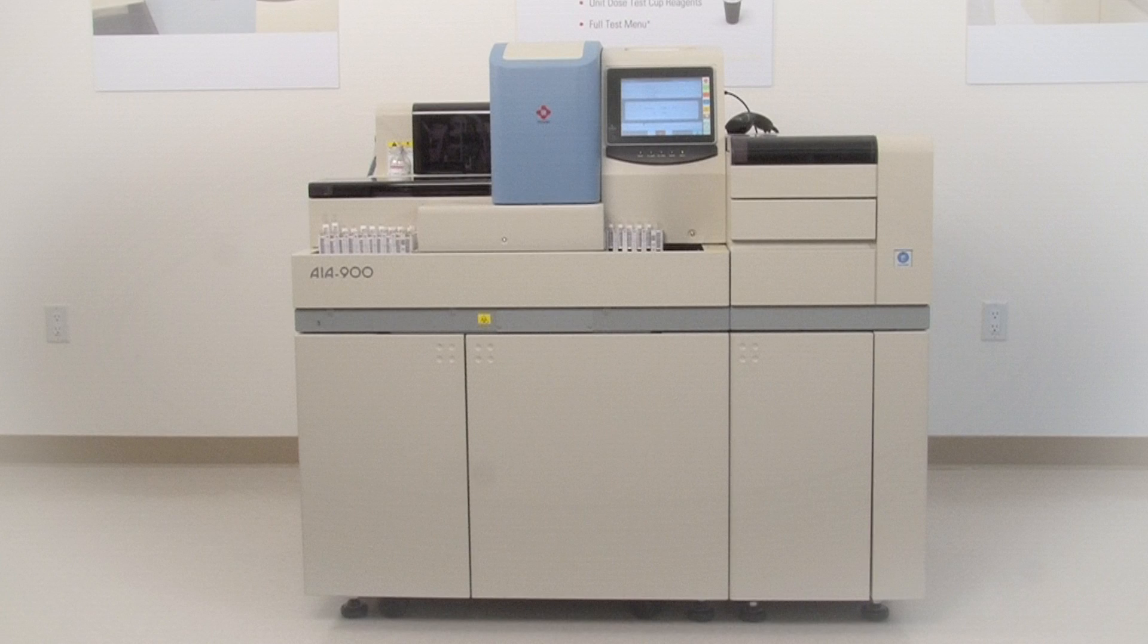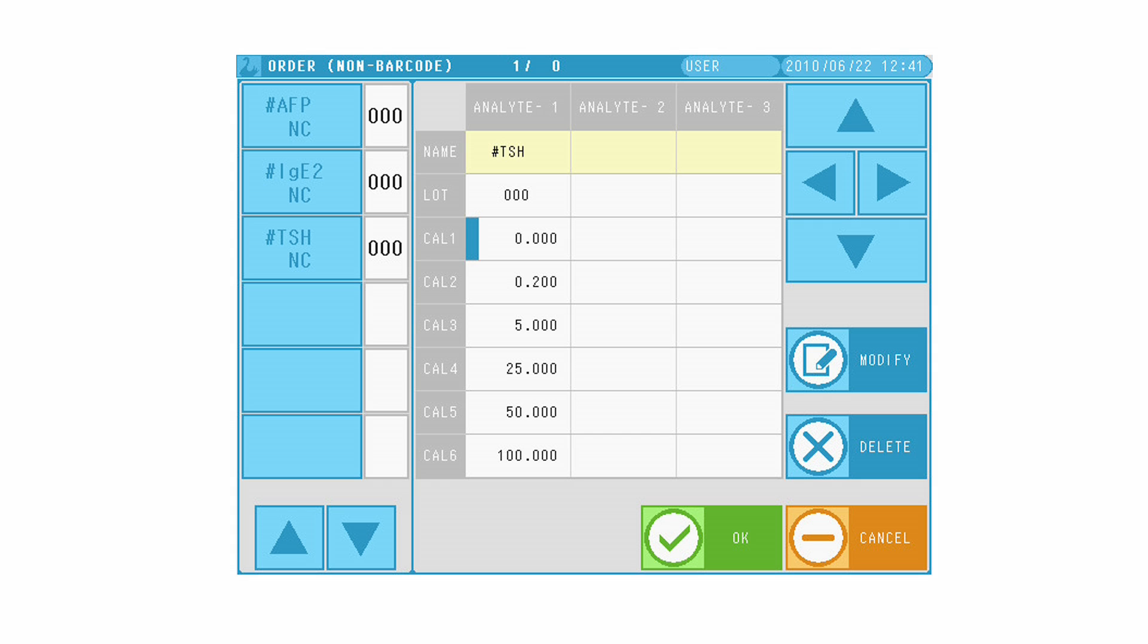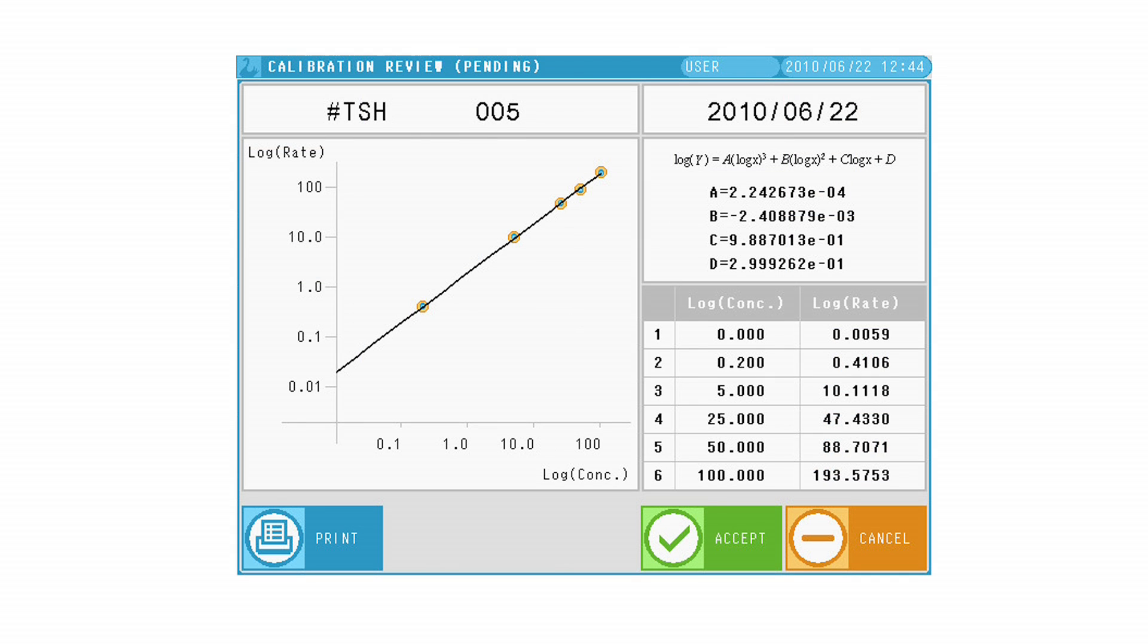Previously assayed test results can be calculated after calibration if the operator chooses to do so. The AIA 900 stores up to two calibration curves per analyte and calibrations are stable for 90 days on most assays.